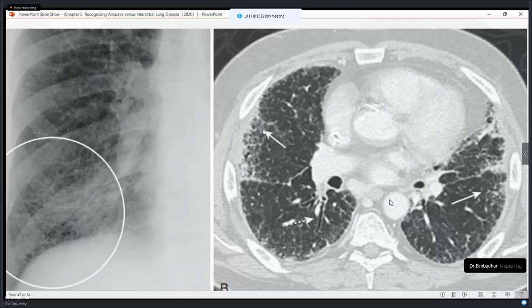At the same time, look at the lung space along the lateral segment of the right middle lobe, and you can also say in the superior segment of the left lingular lobe, you can see that the problem is present down in the peripheries, and there is traction, and there is a progressive, predominant, significant loss of lung space.